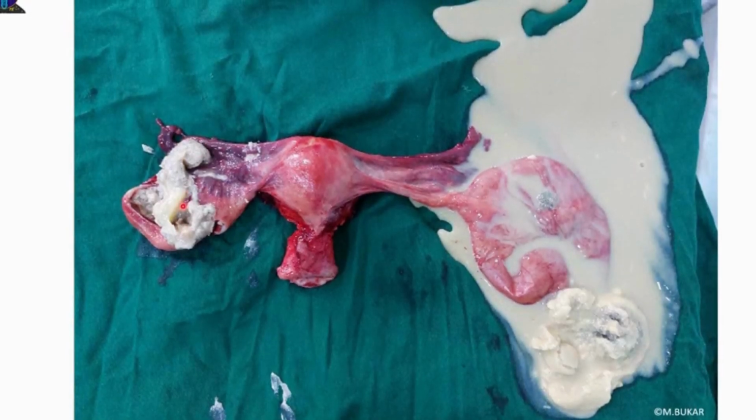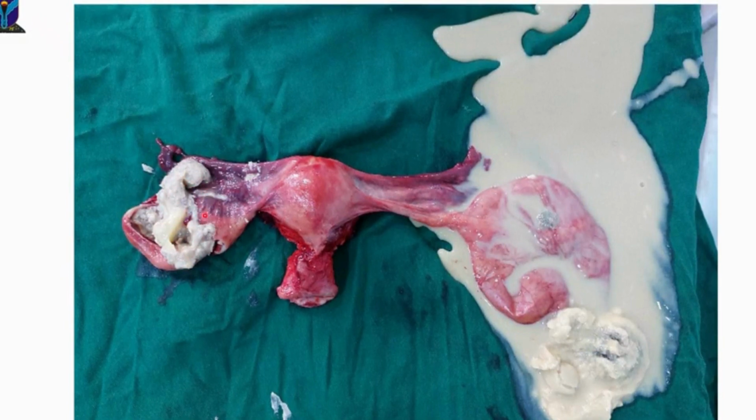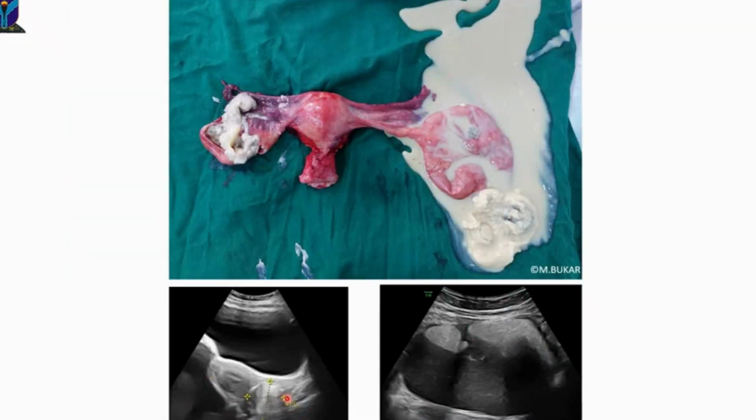So, on cutting the lesions, look at this on the left side. Look at this fat ball, not the hair here, and again, not the Rokitansky nodule, and not the content of the cyst. Again, you can see this is the right cyst, beg your pardon, the right cyst. So not the content here. This is the Rokitansky nodule here. Look at this shadowing probably coming from this here.